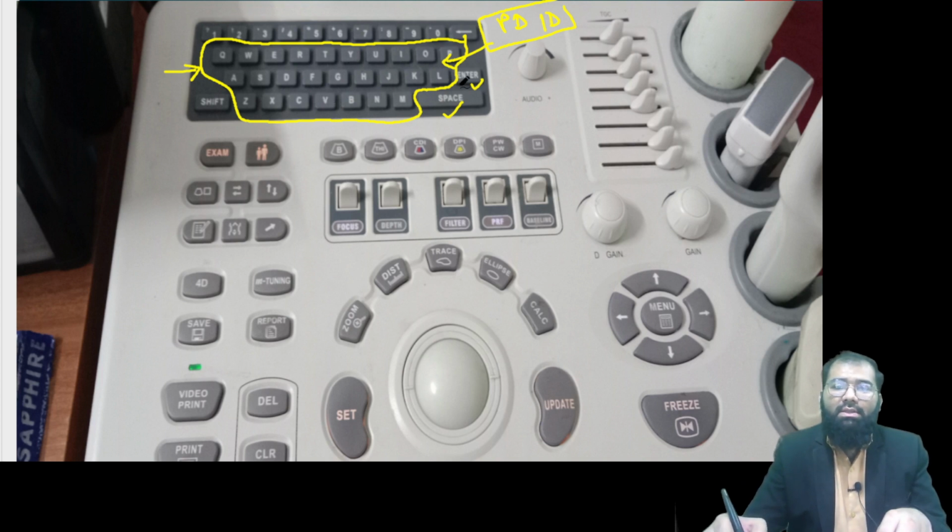Now, very important is there is a specific terminology, what we call annotation.